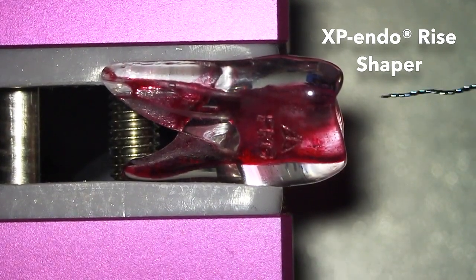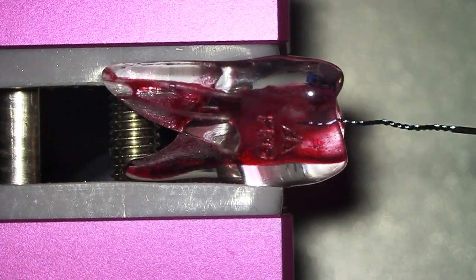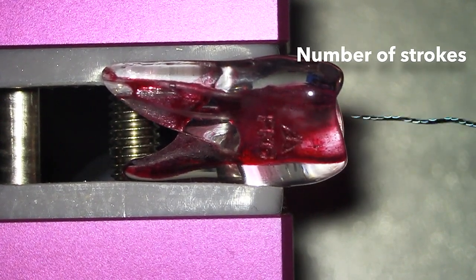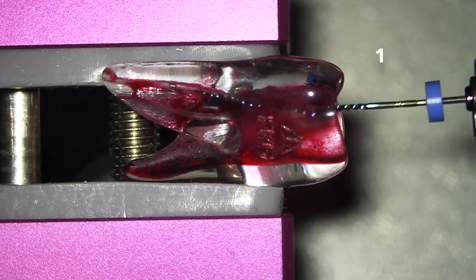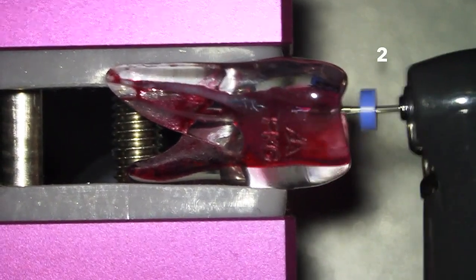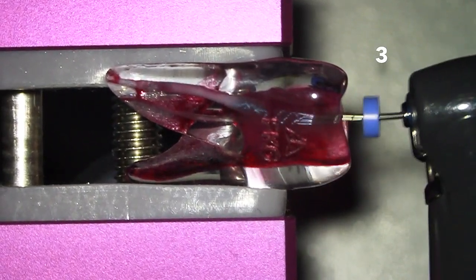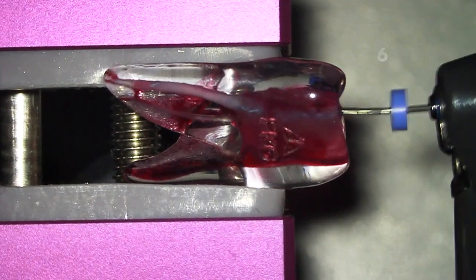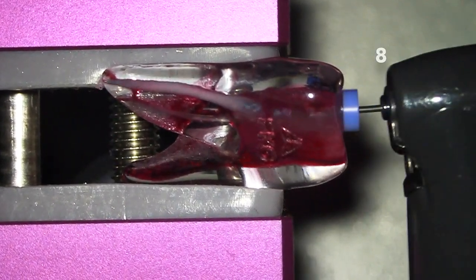Now we are ready to use the XP Endo Rise shaper. Insert the tip of the XP Endo Rise shaper into the canal until resistance, retract a little, and start the motor. Eight long gentle strokes should be used to get to the working length and shape the canal. If not, stop, irrigate, recapitulate with a hand file and proceed again.